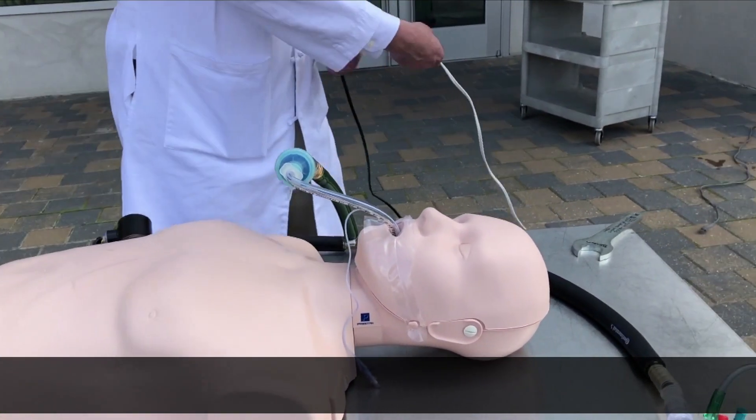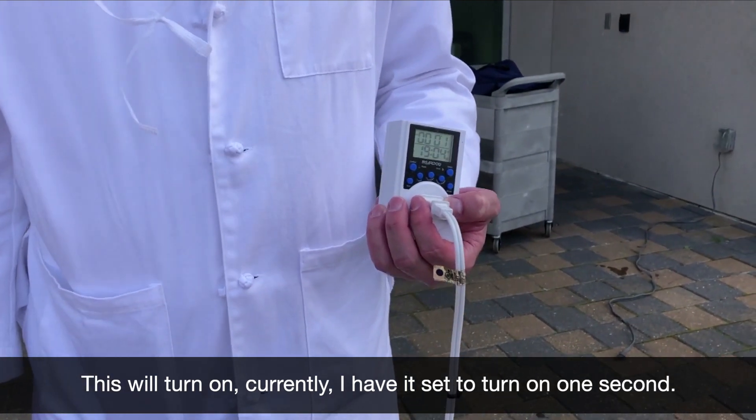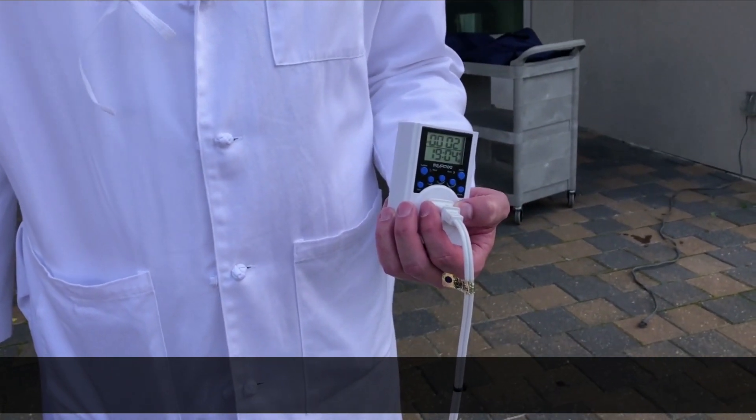The brain of the ventilator is a lamp timer. This will turn on — currently I have it set to turn on one second. Every four seconds it releases the pressure in the lungs and oxygen flows out. And that's the ventilator.